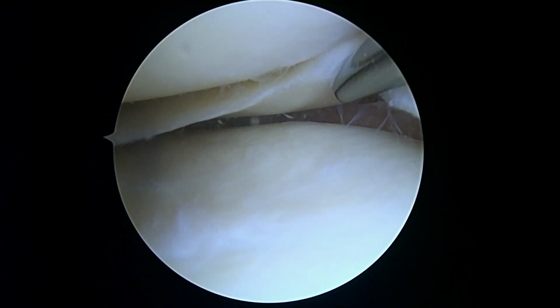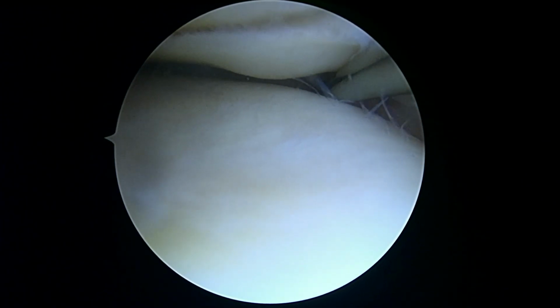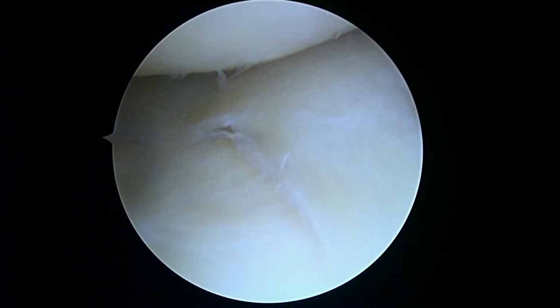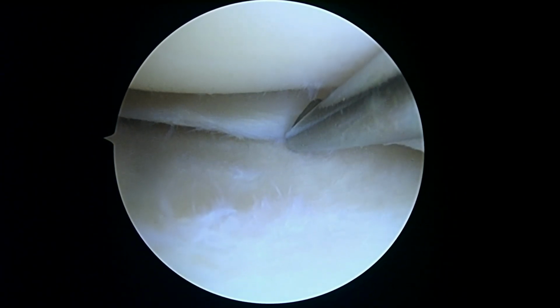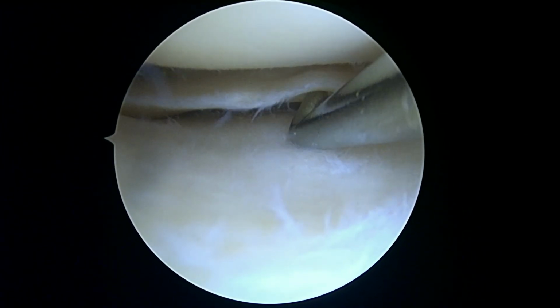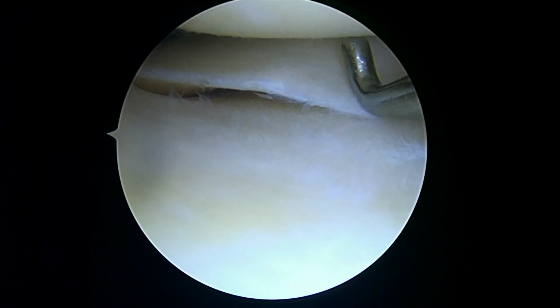So when we look under the meniscus, and we can hook it and pull on it, it's very stable. So I do not see anything that rises to the level of needing to be repaired. We'll look towards the posterior horn back here, and other than this inner edge fraying, which is pretty common as we work and play hard, I don't see any significant tearing back here either.